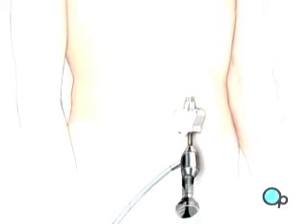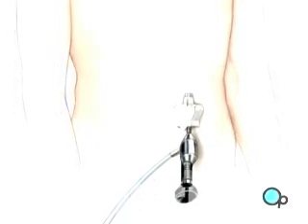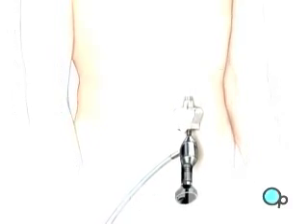An umbilical port is created for the laparoscope. Four more incisions will be made, with care taken to keep the openings as small as possible.